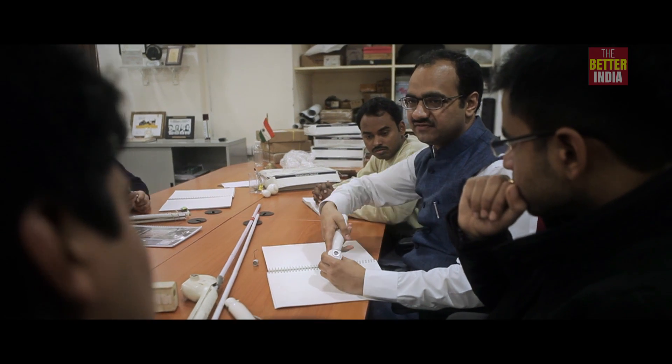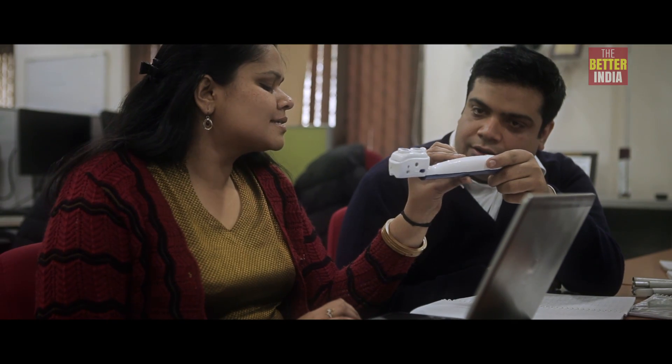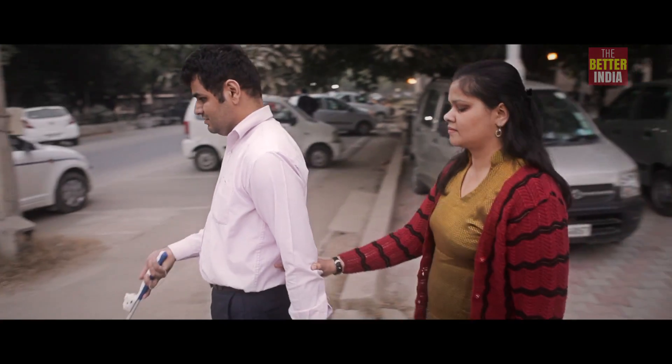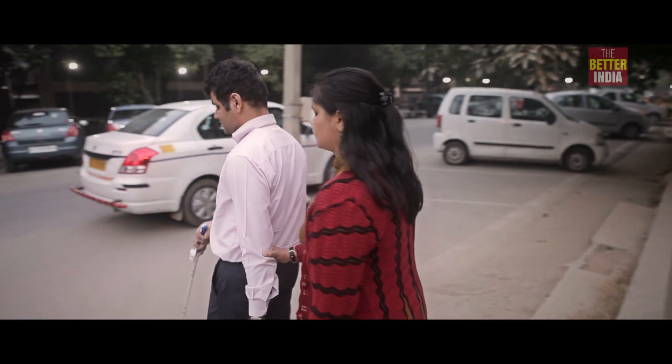For an engineer, there's nothing more beautiful than somebody using your innovation. When we walk in the street and find somebody — whom we don't know, we don't know where they got the device from or where they trained — using it in their day-to-day lives, there's nothing more beautiful than that.